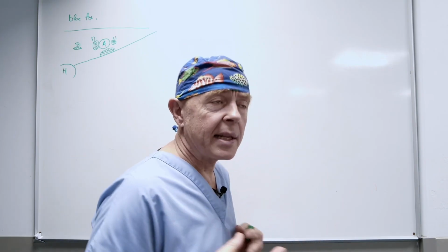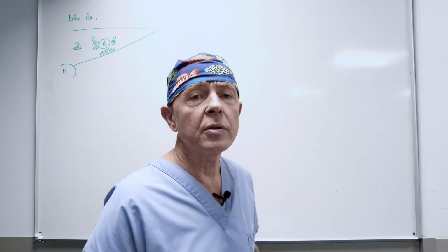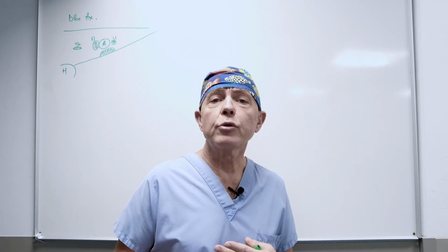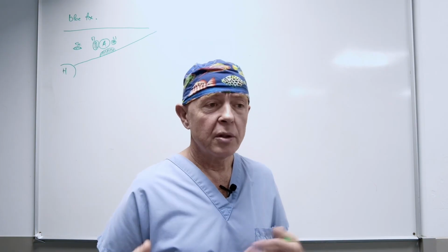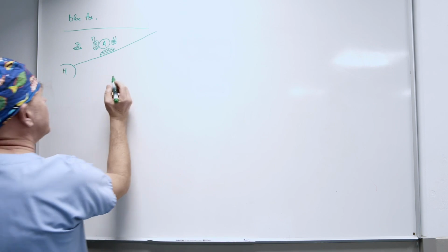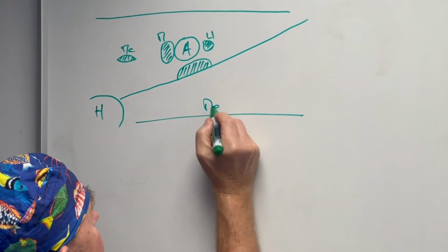It is very crucial to be familiar with them because they assure you a comprehensive beginning to your learning experience. Additionally, ensure that you demonstrate it to your learners or trainers, as these are compact blocks that can be immensely beneficial. Following this, we have the elbow complement of a median nerve block.